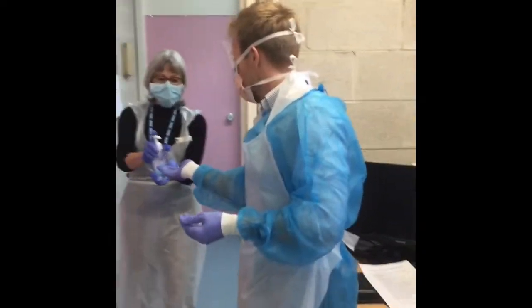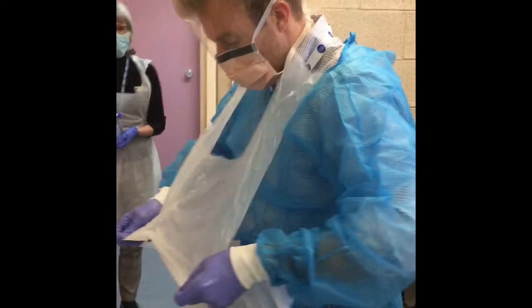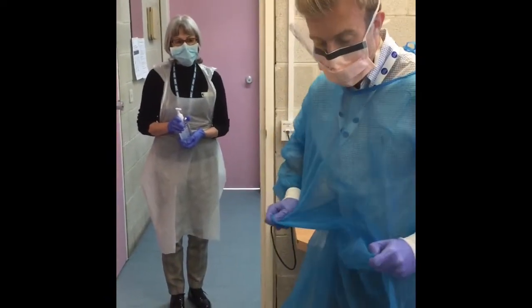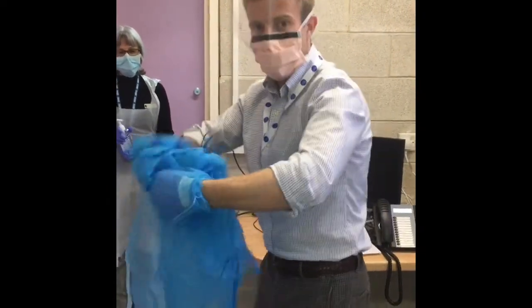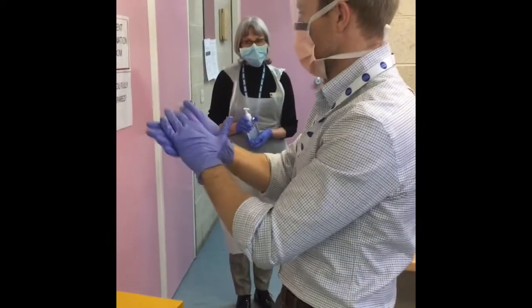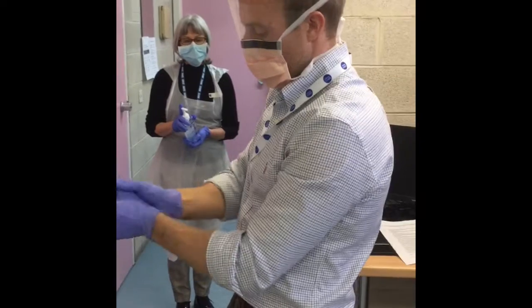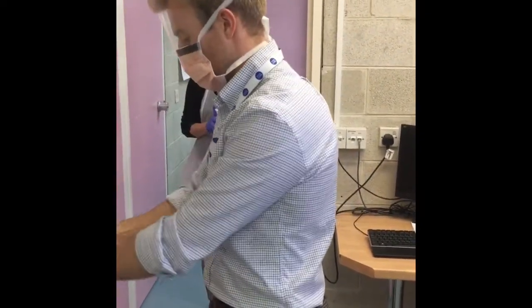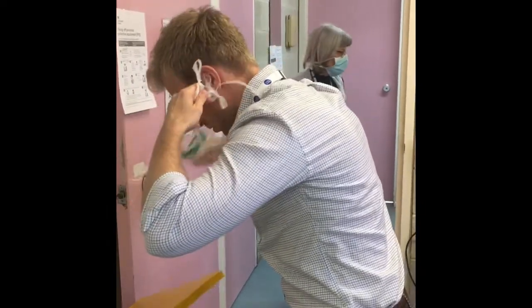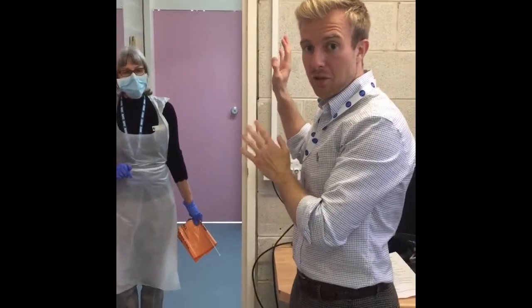At this point you can clean your hands as many times as you want through the procedure. Again A-lift technique. Remember your apron's dirty so you want to remove it and roll it into a ball so the dirty stuff's in the middle — just trying to decrease contamination. This may well rip but we want to remove this from the front, rolling it like that, maintaining your gloves on which shouldn't come off because you put them on first. So what I'm going to do now is clean my hands again. Last step before you take your mask off — you're doing this all facing down, not touching the front at all — and dropping into the bin. That's me done. Wash my hands again and I'm going to step back through into the clean zone.